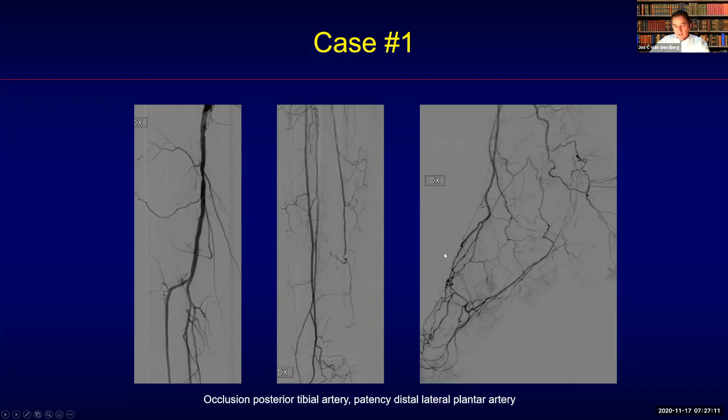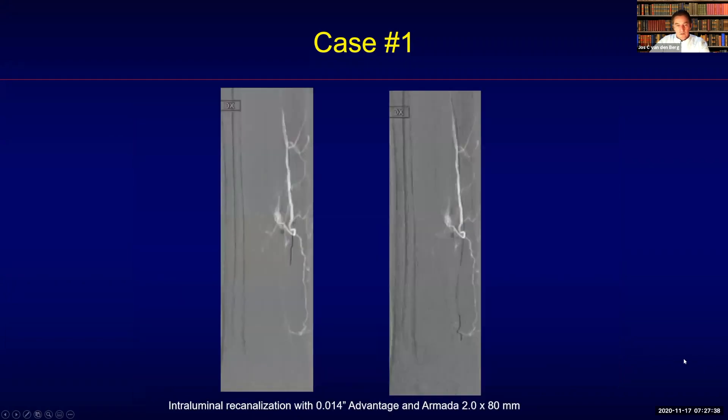You can see with difficulty a connection between the anterior and the posterior circulation, and a very good quality of the anterior tibial artery — but of course with non-healing ulcers on the second and third digit. Although this looks pretty good distally, it was not enough. So even with a distal connection visible, I decided to revascularize also the posterior tibial artery.